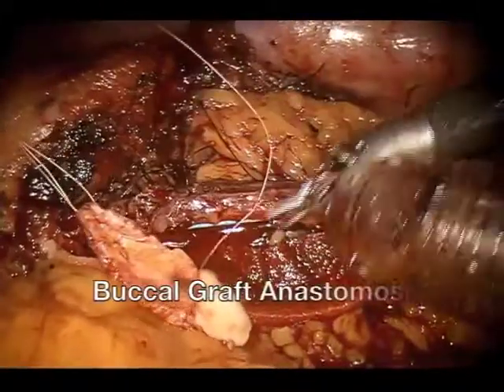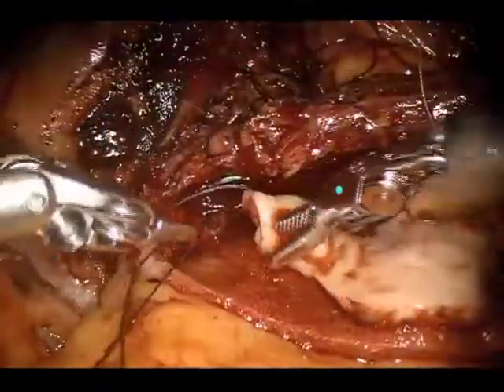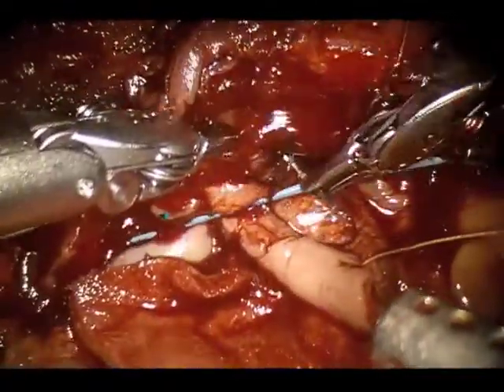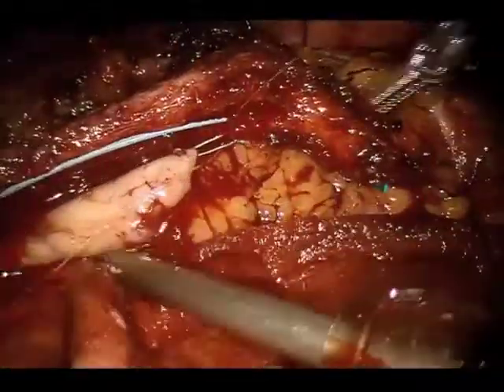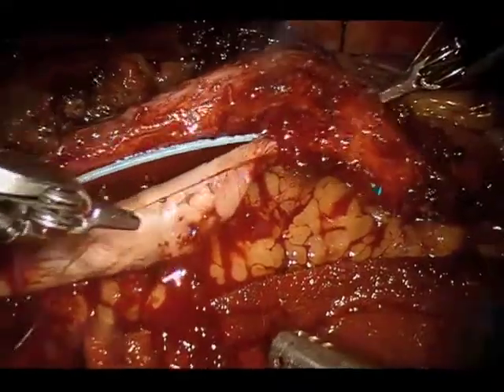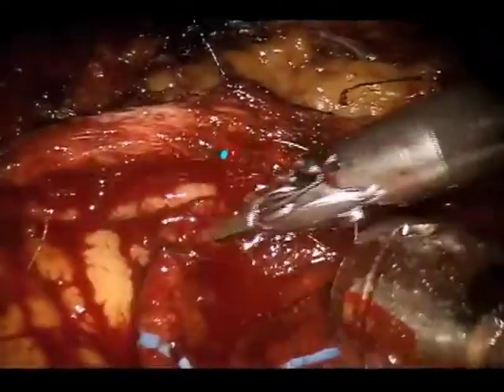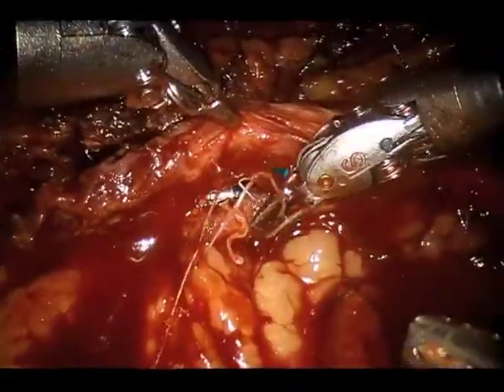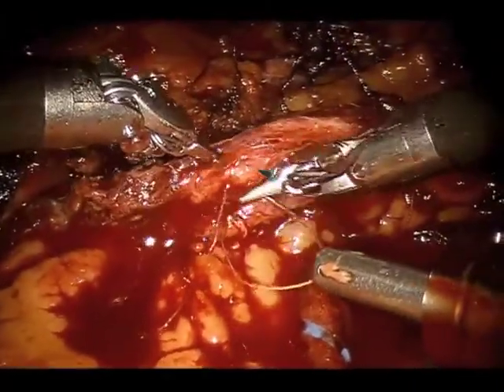The graft was introduced into the abdomen and anastomosed to the ureter in a dorsal onlay fashion. Interrupted sutures of Vicryl were used to secure the graft at the ends of the ureterotomy. The graft was then sutured to the edges of the ureterotomy in a running fashion, and was also approximated to the omentum using the same running suture.